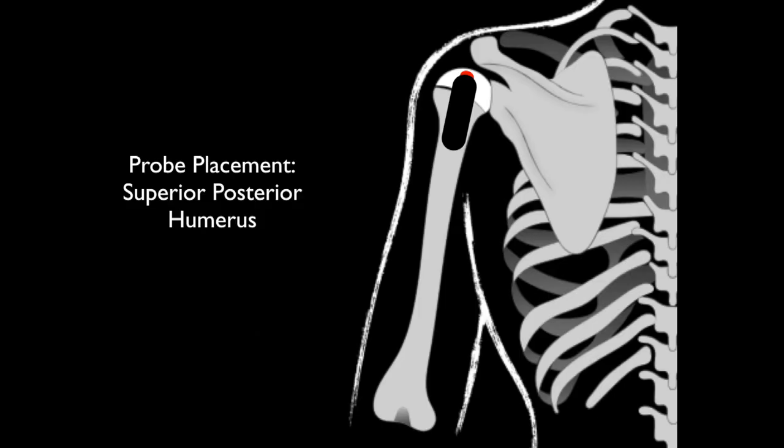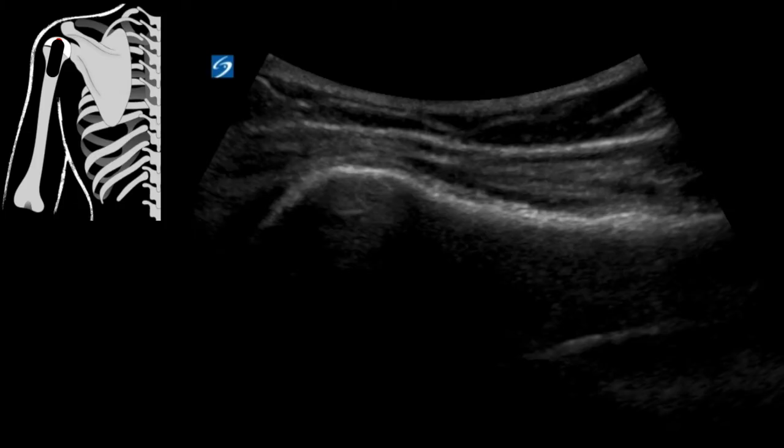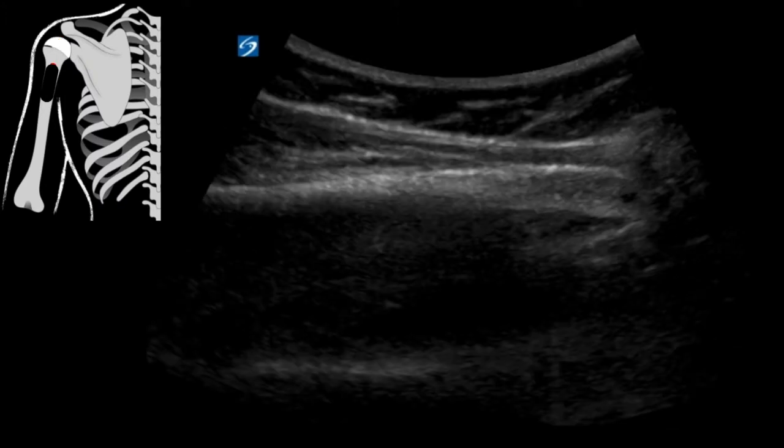After that, I like to put the probe over the superior posterior humerus — this allows me to look for any fractures. I'm going to look right along this line: this is our humerus coming down, here's your humeral head, the neck, and coming towards the body of the humerus. Then I just drag inferior so I can evaluate the proximal third of the humerus.